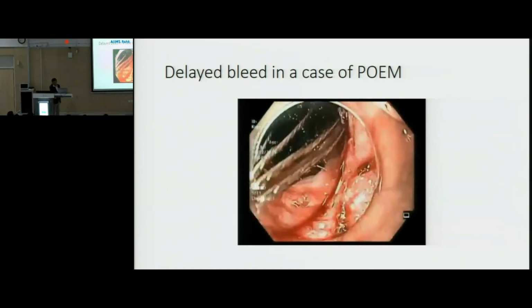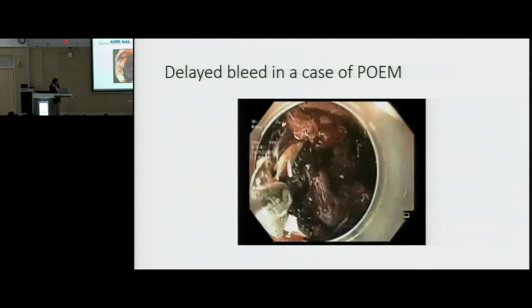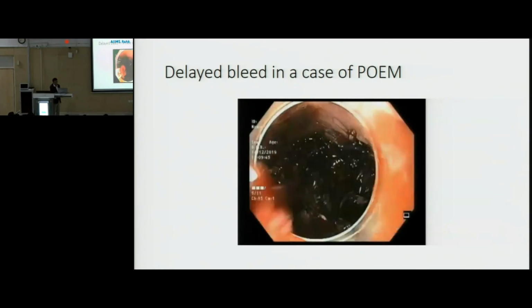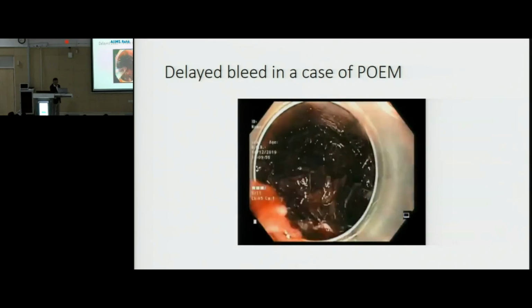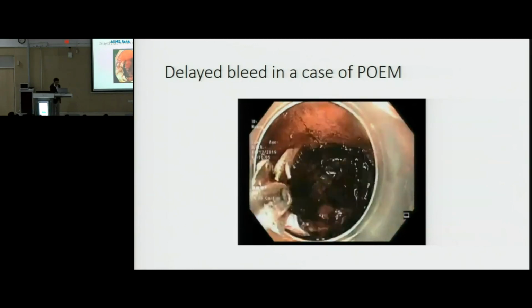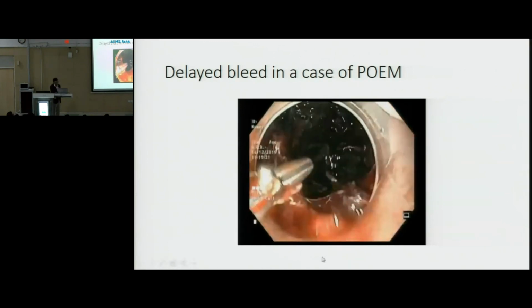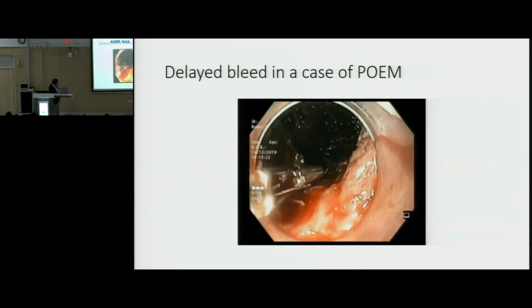Inferiorly, where we had cut the muscle, there was a spurter. So we have a forceps. This is a forceps. With the forceps, we can catch hold of the spurter and stop the bleeding. We achieve hemostasis. Then we closed. So you can see the spurter. It will come. Yeah, this here. Inferiorly, see. You can see here. Just here. Here was the spurter.